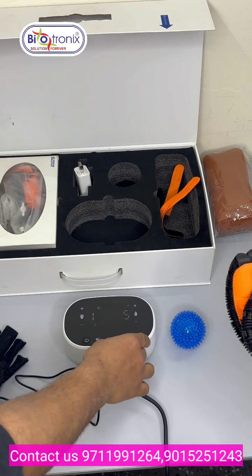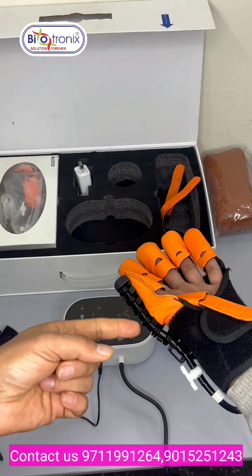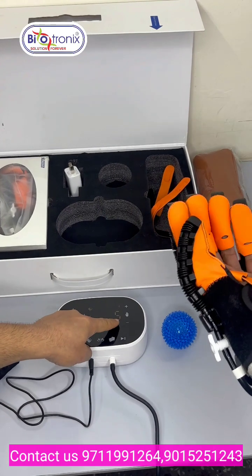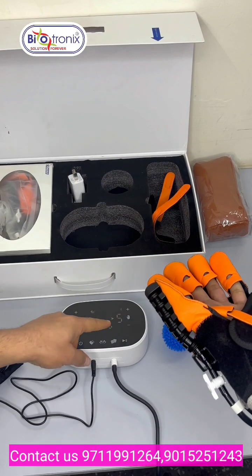So I am now going to show you. I am just starting it, and you can see this is the extension. It will wait for 5 seconds, as it is set to 5 seconds. Now this is the flexion, 1 second only. Then it will start and wait for the 5 seconds.